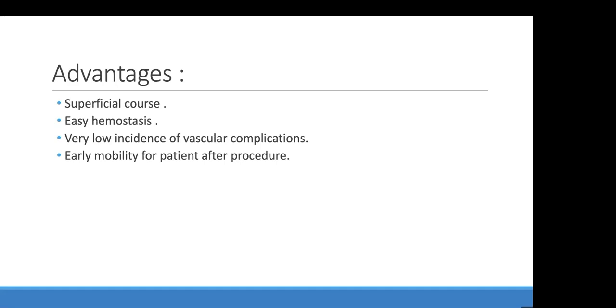Doing a radial in a center that is overwhelmed with patients is effective, or for observing if there is a femoral problem. So it's for the patient's privilege, if they can go home immediately, maybe an hour after the procedure, even if it was a PCI.